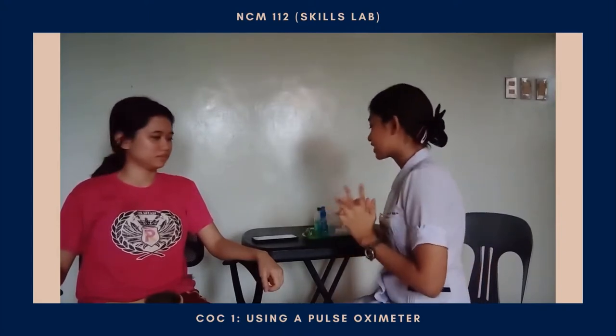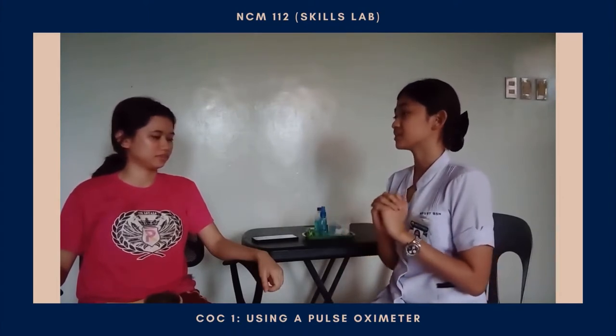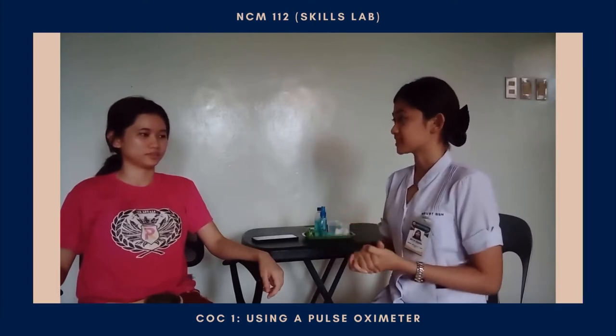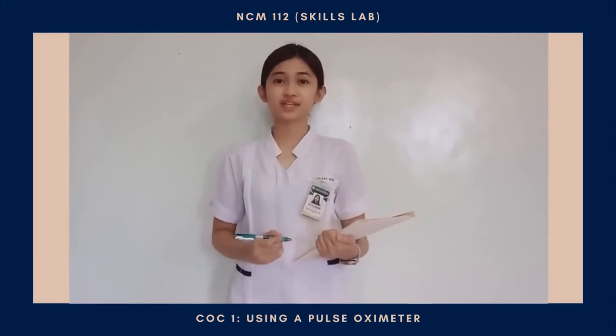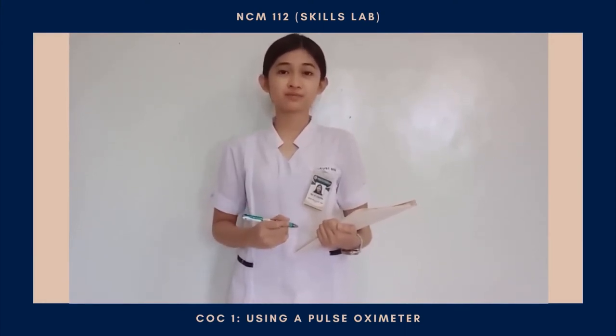Okay, ma'am, your reading is 98%, which means that the oxygen in your body is good. And thank you for cooperating in the procedure. Document the procedure done as well as the reading. If the reading is abnormal, we should notify the primary care provider immediately.